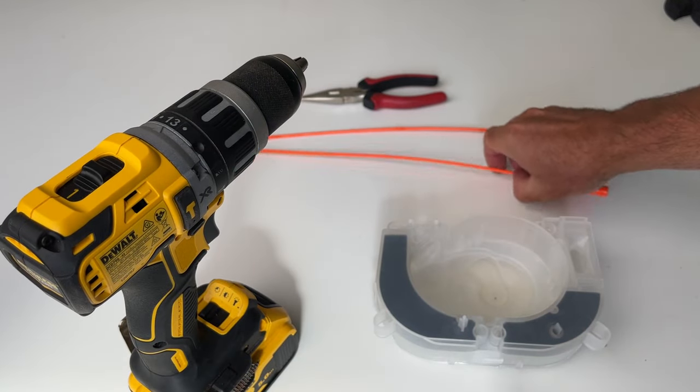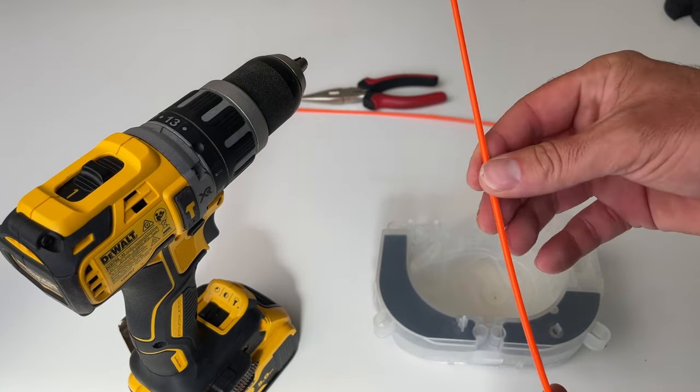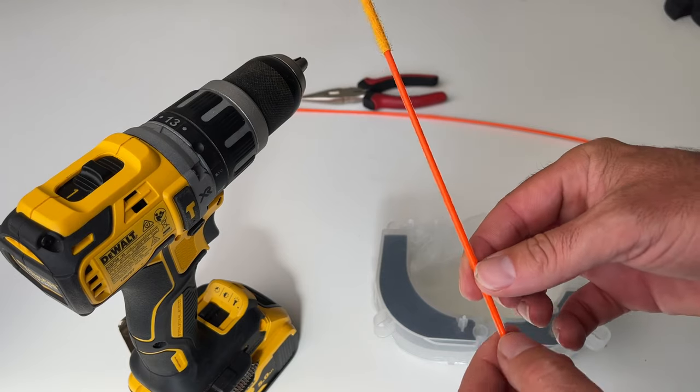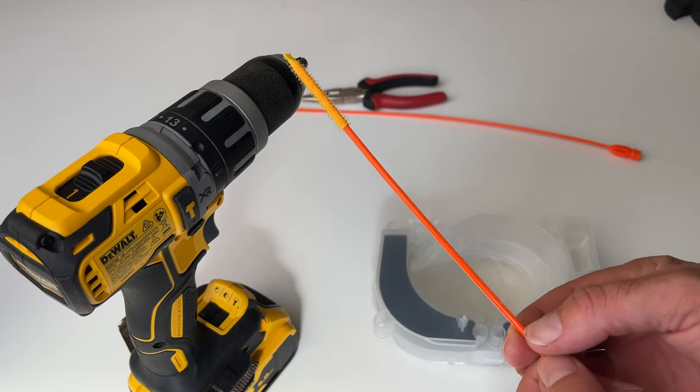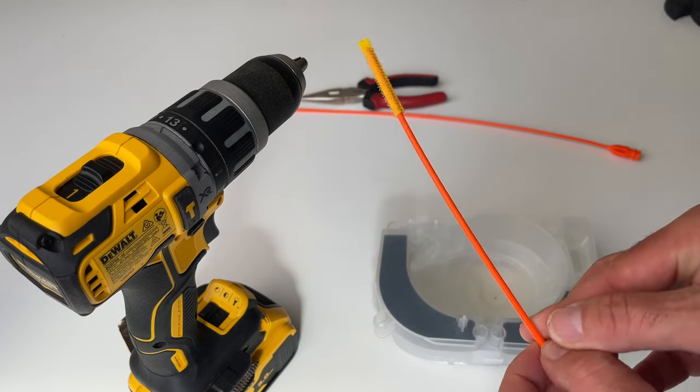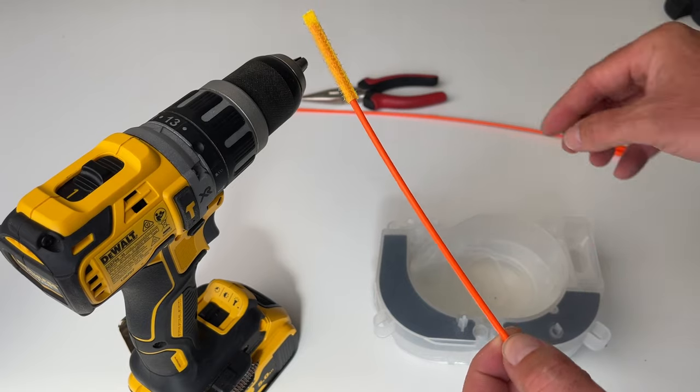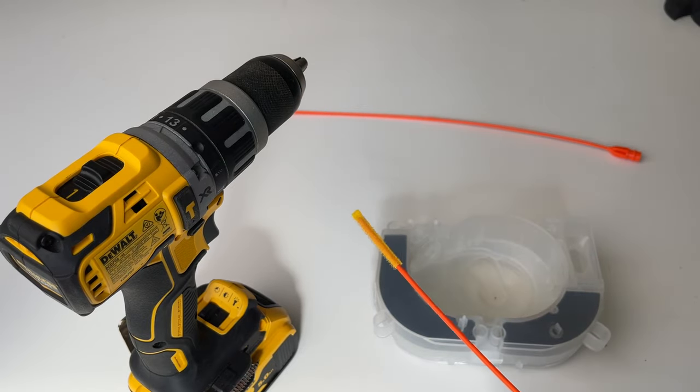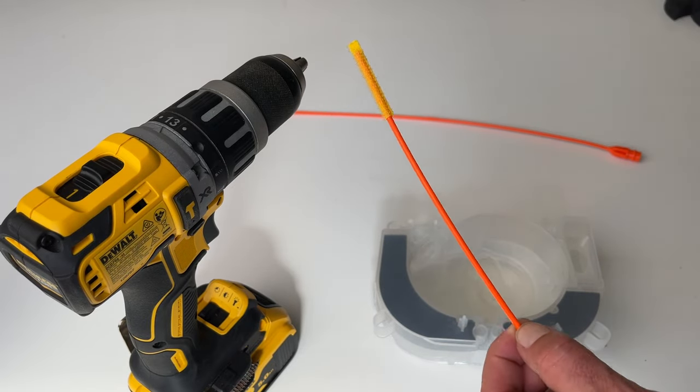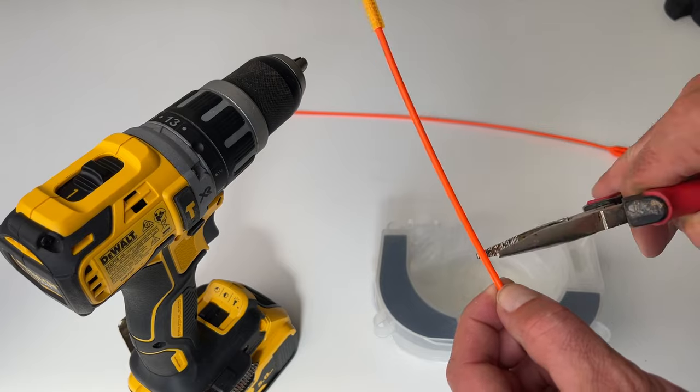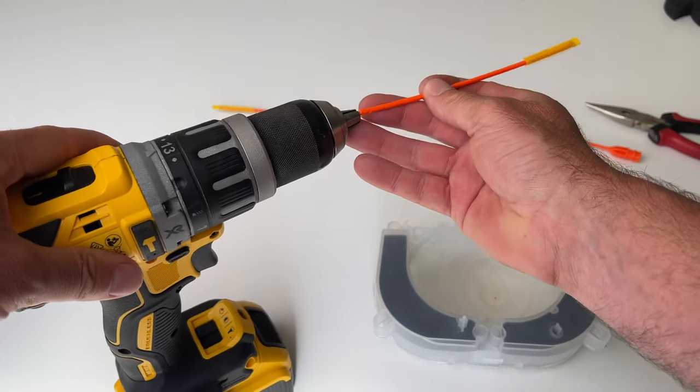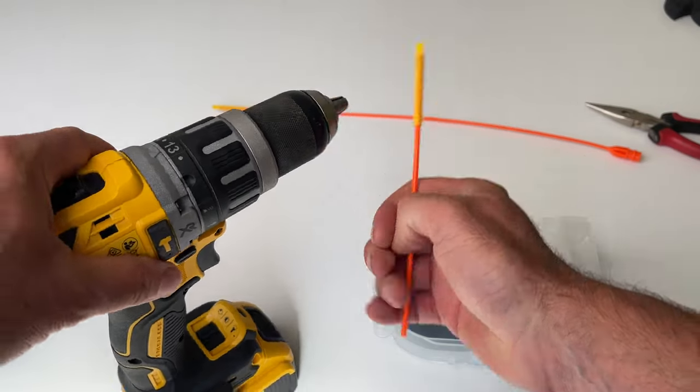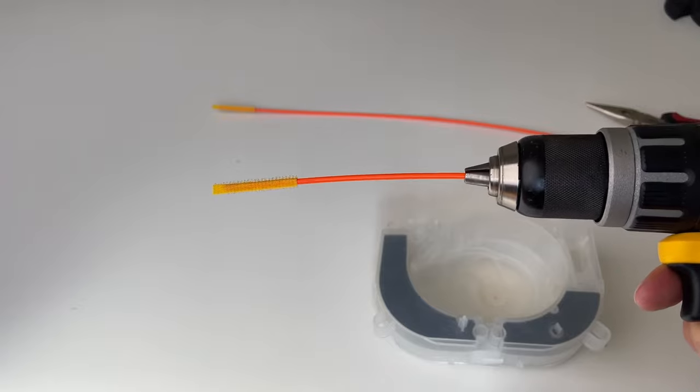So, what we're going to do here is with our Drain Weasel, we need to trim it a bit, so maybe about 6 inches, I think, is probably good, sort of that sort of distance. And now we're just going to put it in our drill. All right, so it looks like that.